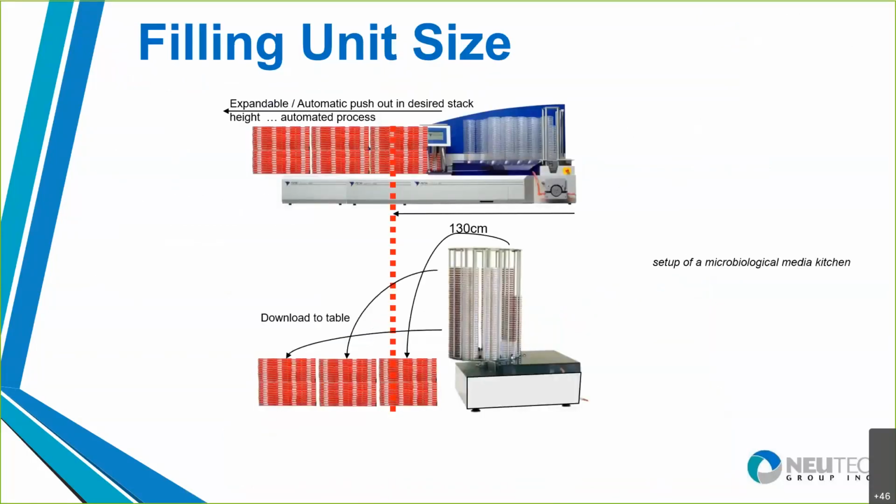Now, one of the things that's maybe been a concern for this linear approach is just the size. It does have a sizable footprint, and depending on how many dishes you want to do at a time, that can increase if you're going to leave them there after they've been filled. But in reality, if you compare to a traditional carousel approach, if you're going to take the plates out of the carousel, at some point they have to be taken out. They're really going to fill up pretty much the same space. So you're still going to need that footprint, even if you use a carousel approach. In terms of comparison that way, there's really not a lot of difference.